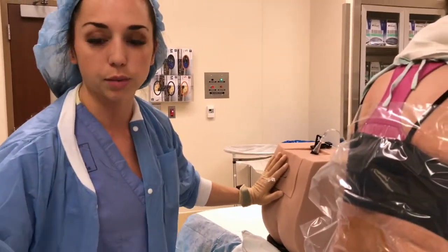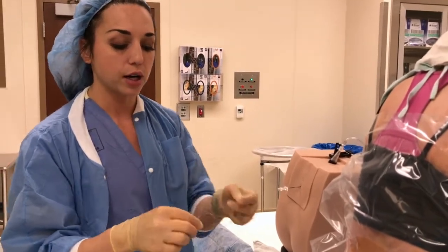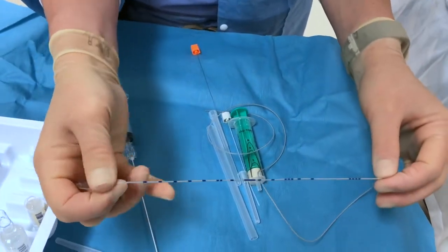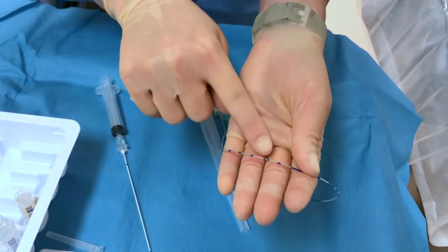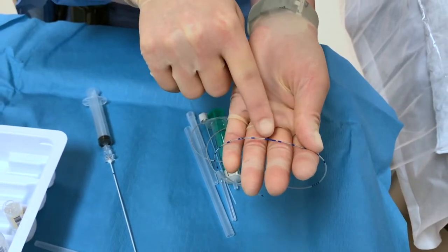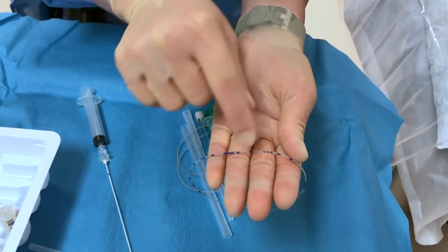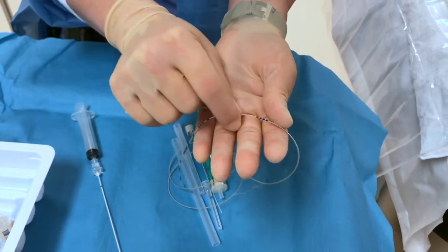At this point, we're going to place the epidural. Now recall, so here's our epidural catheter. Quickly, the numbering on the epidural catheter, the dashes are in increments of 5. The first one that you'll notice is this double dash, 5 times 2 is 10. The next one that we get to is this thick line, and that's 12. So 10, 11, 12, 13, 14, and then 5 times 3 is 15, 16, 17, 18, 19 is not there, and then 20.